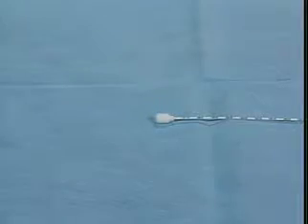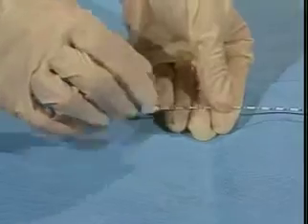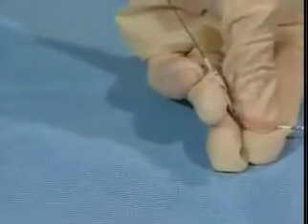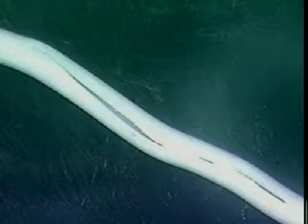The catheter guide wire can also cause catheter cuts. Removing a guide wire too quickly, especially from a catheter that follows sharp angles, can slice the catheter from the inside out.